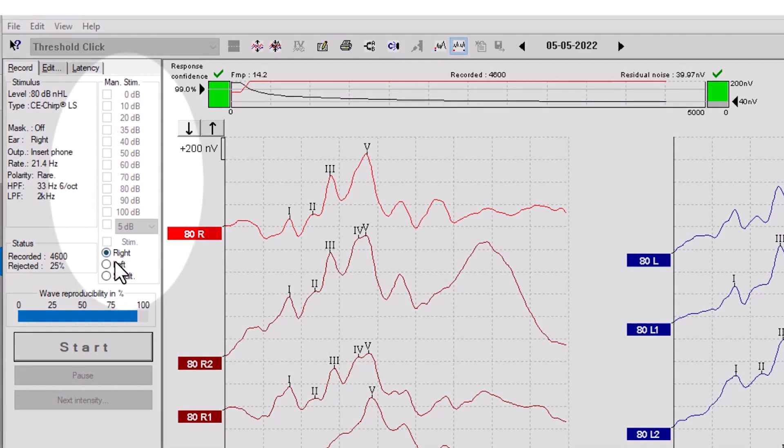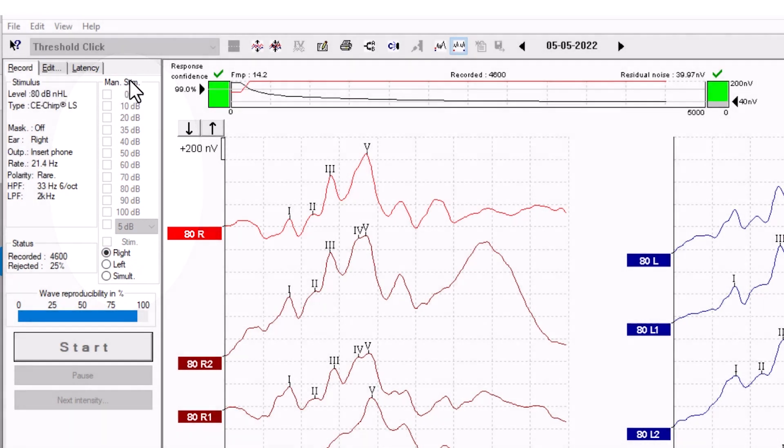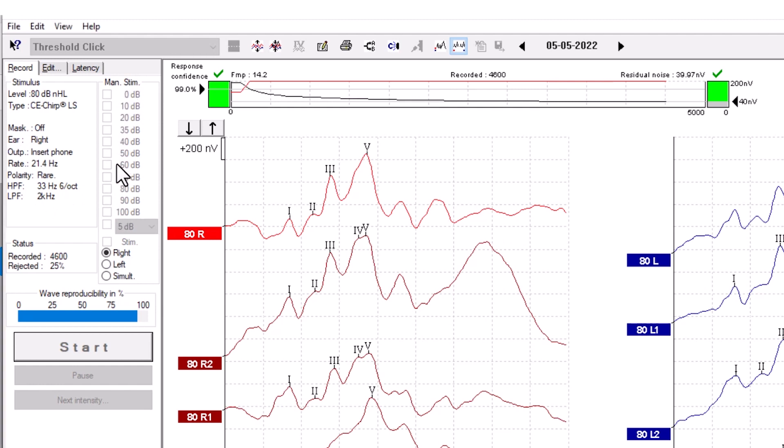This tab to the right of the stimulus window is called Manual Stimulation, which allows you to choose what intensity you want to stimulate with. Select the intensity and press Start.